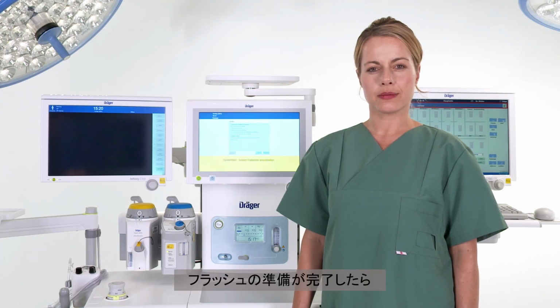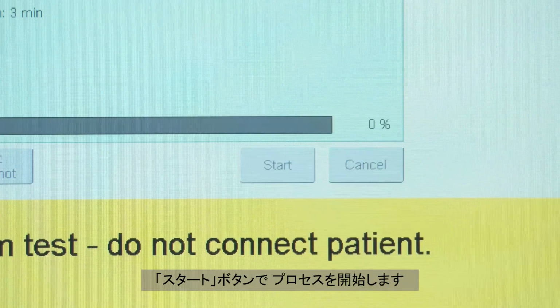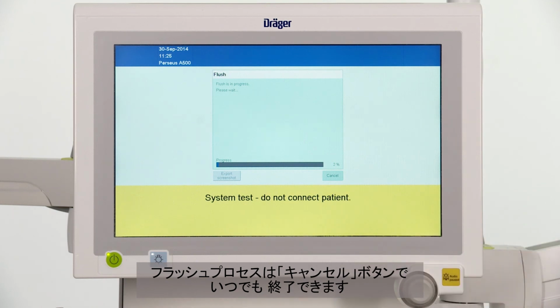After completing the preparatory steps for the flushing process, use the Start button to initiate the process. You can terminate the flushing process at any time using the Cancel button.